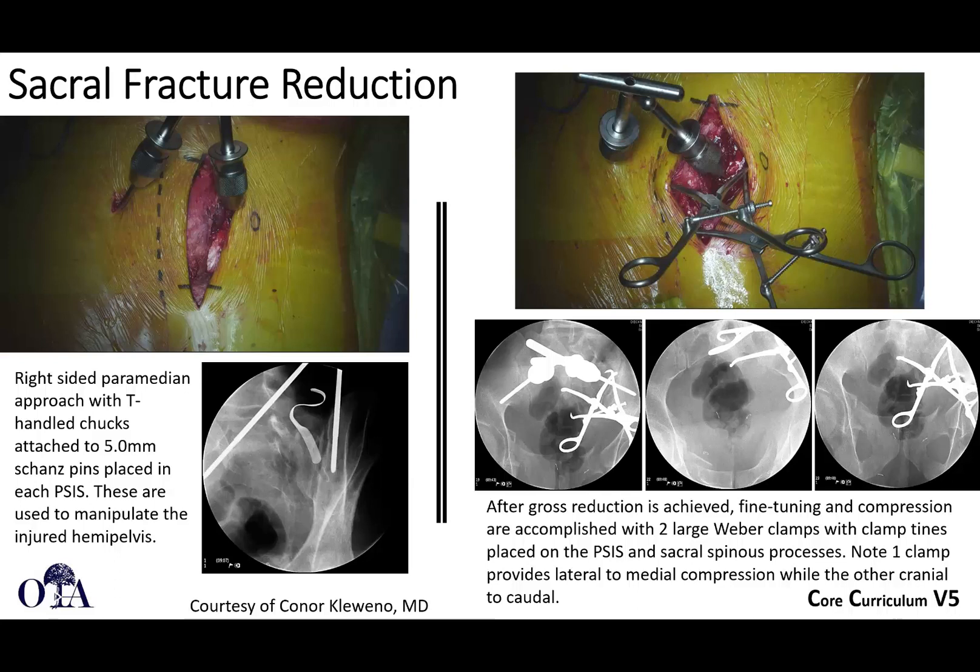As shown here, you have basically Schanz pins attached to T-handle chucks. You may also need to have traction in place, and these are used to manipulate the hemipelvis and get a reduction that way. Then you can fix with iliosacral screws, or using other techniques. We're going to show some other methods such as transiliac plating — that's another technique that you use a similar approach for.